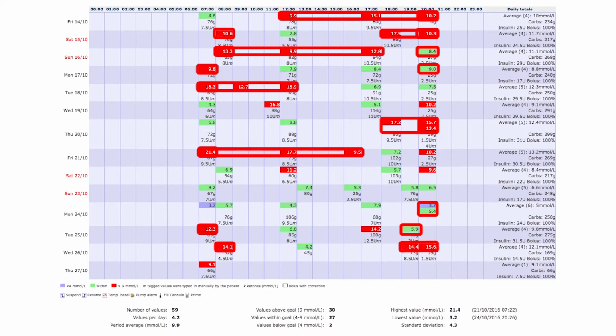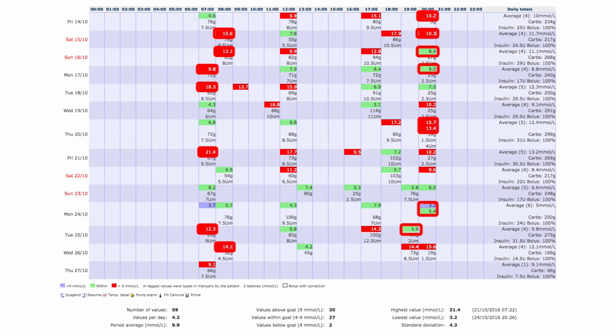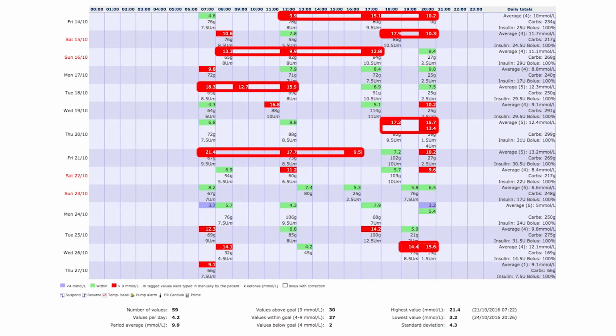Now that you have identified patterns and checked the basal background insulin percentage, you can decide which therapy adjustment is necessary. In this example, the therapy adjustment would be, with the rise from bed to waking most of the time and background insulin at only 26%, it would be advisable to start with increasing the background insulin. A second option, after assessing the effect of the background insulin, would be to make the insulin sensitivity factor stronger.